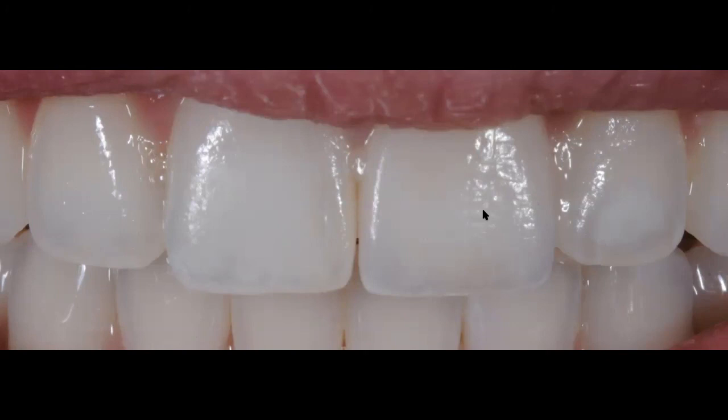I'm giving them all this shade information. And when I read articles by McLaren, and articles by different authors talking about shade selection, how to take photos and how to combine all this, you can see that people doing this type of dentistry and achieving these results are giving their labs a lot of information.